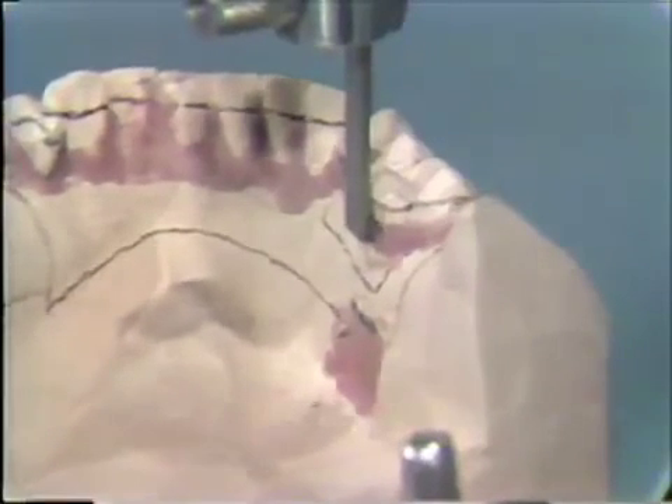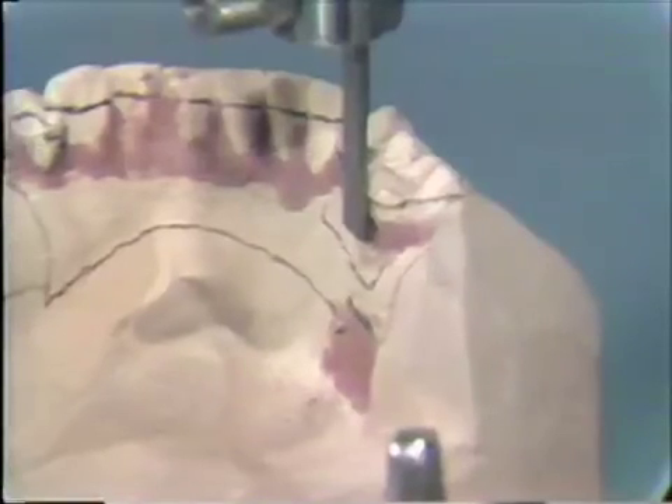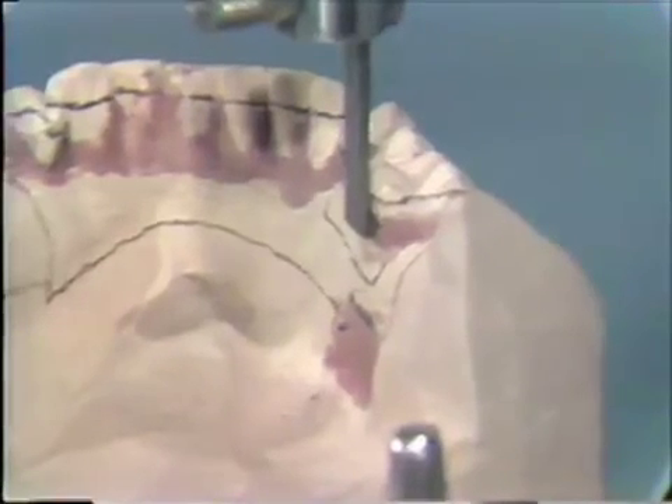We have discussed the parts of the dental surveyor and demonstrated some of its uses in removable partial denture prosthodontics. In addition, the surveyor has many other uses in complete denture prosthodontics, crown and bridge prosthodontics, and general restorative dentistry. These procedures will be demonstrated as they occur later on. In our opinion, the dental surveyor is one of the most important instruments in the dental office armamentarium. As such, every dentist should own a surveyor and should know how to use one with a fair degree of competence.